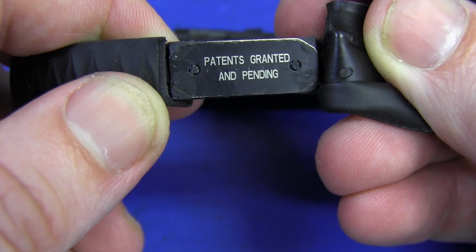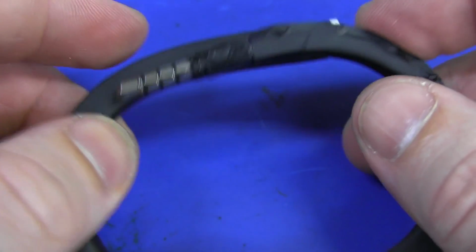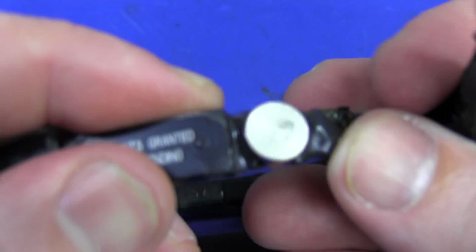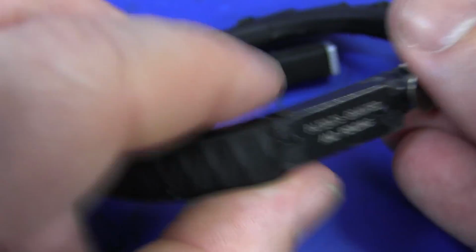Oh dear, patents granted and pending. Whoop-de-freaking-do. And by the way, Mike did a teardown of the Nike Fuel band, and I think that's a competitor to this UP Jawbone. And oh, look at that. What's that? Is it a magnet or something? I don't know. Gonna have to check it out. Aha, we're sort of getting into some wires and stuff now. So yeah, let me do a bit more work on this.